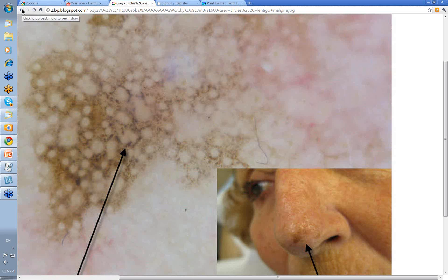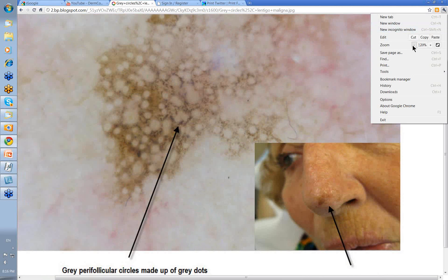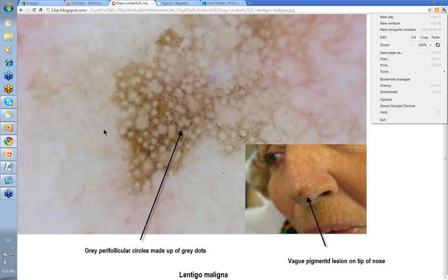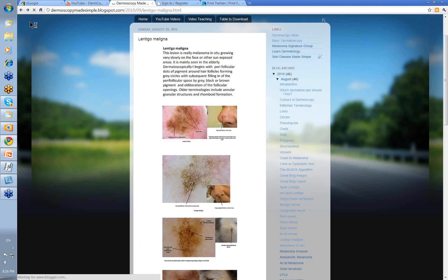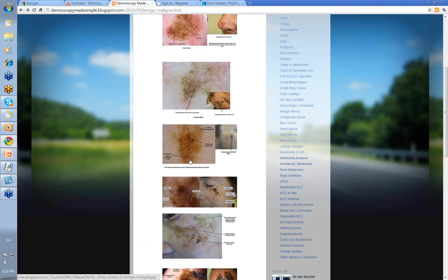I'm not going to go into treatments just now — that's for another day and another time. So, gray circles are one of the hallmarks of lentigo maligna.